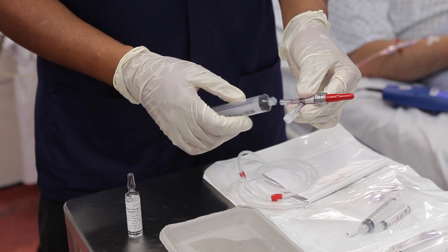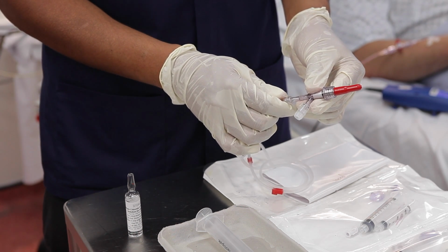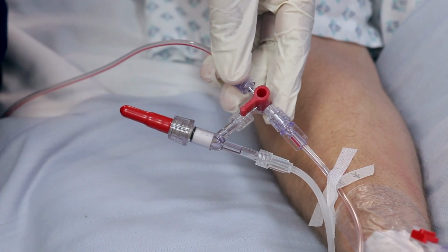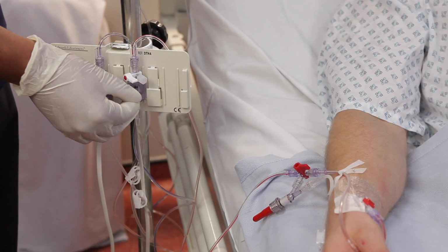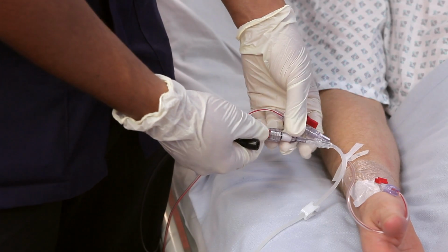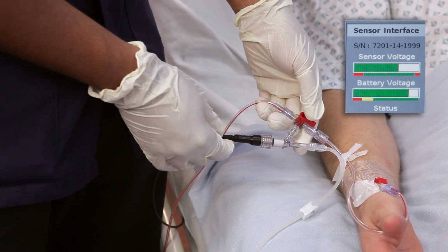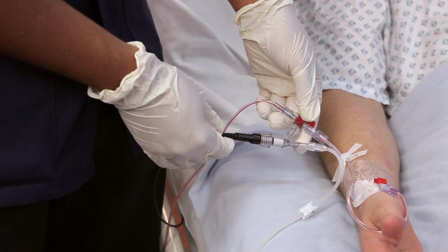Next, attach the blood collection bag to the sensor, and once you've done this, connect the sensor to the arterial line. Flush the sensor via the transducer to remove any air bubbles. Now attach the sensor to the sensor cable, and you'll see the sensor and battery voltage turn green. If the sensor voltage is red, try flushing again to remove all air bubbles.